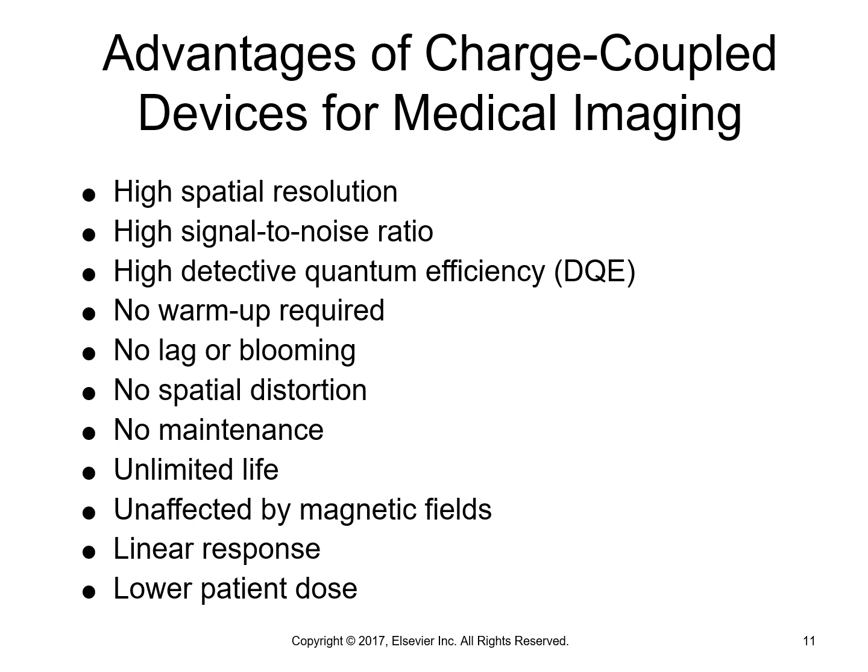Screen film at its best only captured 30% of the X-ray beam. I'll say that again. Screen film technology, what we used for about 100 years to make medical X-rays, only caught about 30% of the X-ray going through it. 70% of the X-ray just kept on going through the cassette. Now we capture about 66%, 2 out of every 3 photons. And so that's what detective quantum efficiency is. The more efficient the image receptor, the higher their detective quantum efficiency is. So we engineer these things to catch photons. How good are they at catching those photons? That's what DQE is measuring.